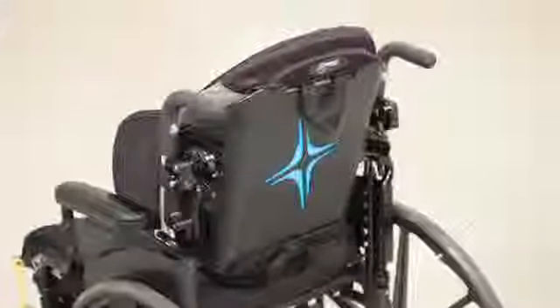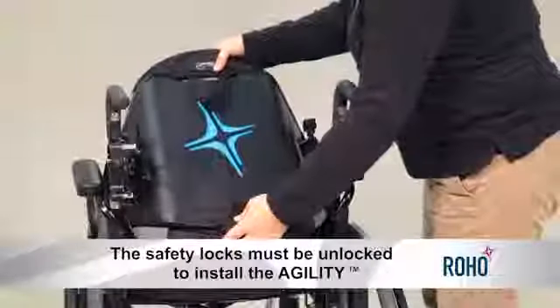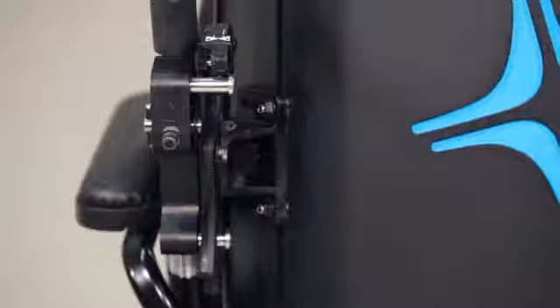Now you can put the backrest on the wheelchair. Don't forget the safety locks must be unlocked in order to install the Agility. Tilt the top of the back shell towards the front of the chair. Hook the lower ends of the double hooks onto the lower pins of the back cane brackets. Tilt the back shell toward the back canes until the latches rest on the upper pins.